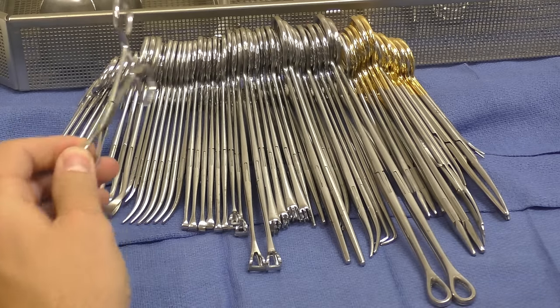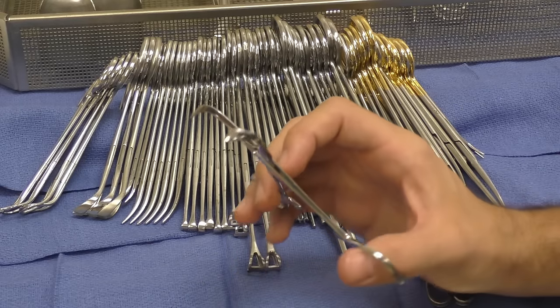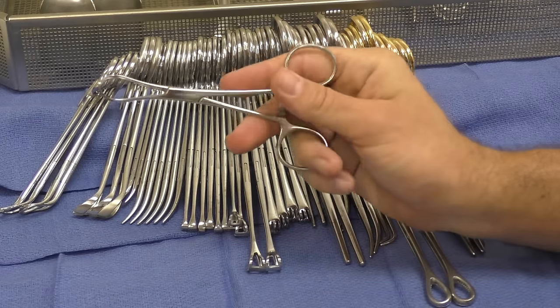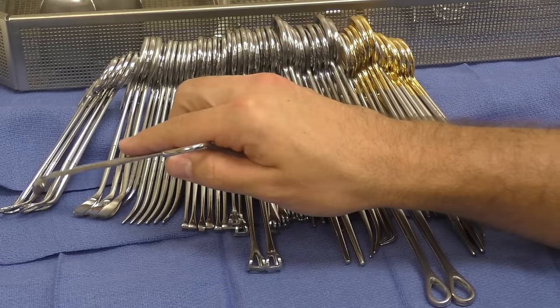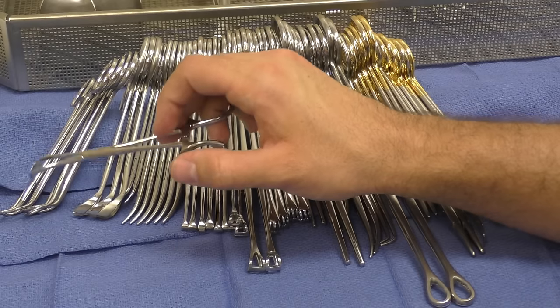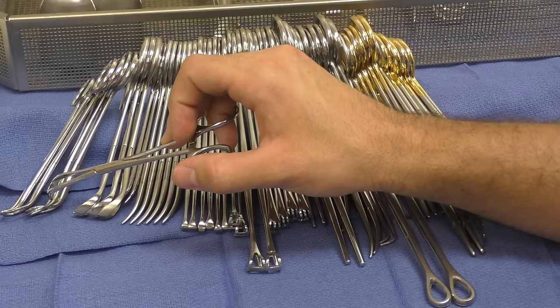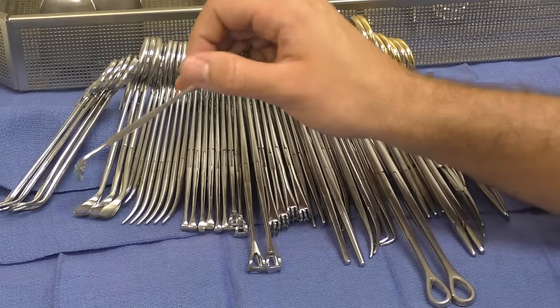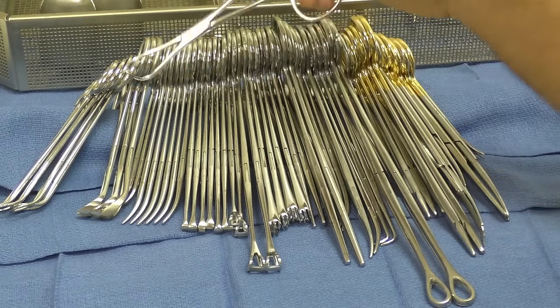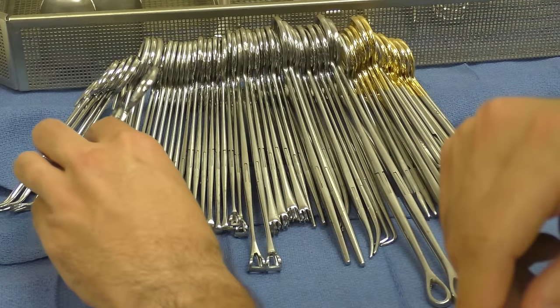Next we have the dull towel clip, also known as the Lorna towel clamp. I personally like to use these for the bovie holders and stuff like that on the field. If you use these sharp towel clips, you're going to be piercing through the drapes themselves, and that is piercing through a somewhat sterile field, so it's not a good idea to use these sharp towel clips for that reason. I definitely prefer using the dull towel clips, and if I don't have these available, I'll just use a Kelly clamp or something like that to hold the bovie holder on.